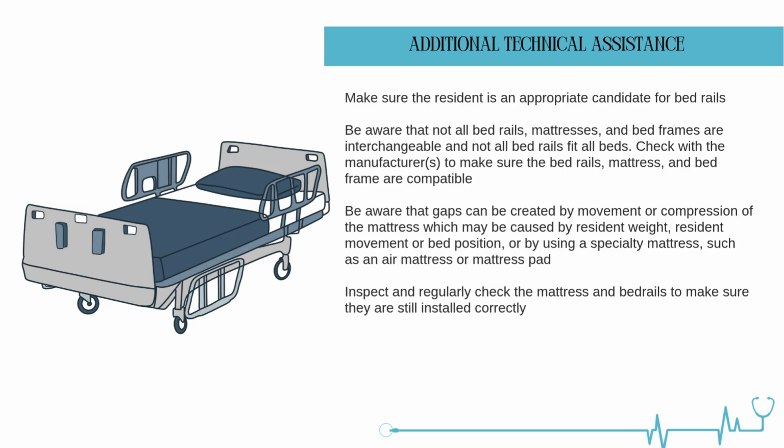Be aware that gaps can be created by movement or compression of the mattress, which may be caused by resident weight, resident movement or bed position, or by using a specialty mattress, such as an air mattress or mattress pad. Inspect and regularly check the mattress and bed rails to make sure they are still installed correctly.